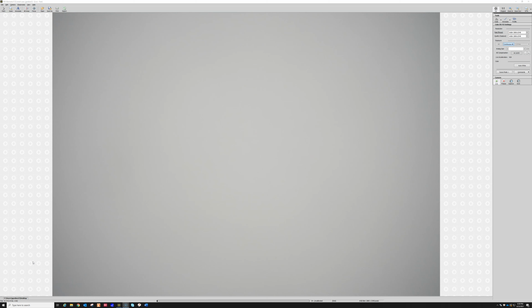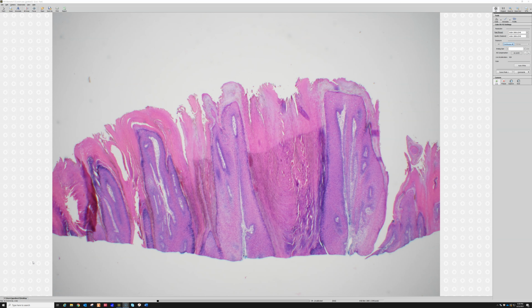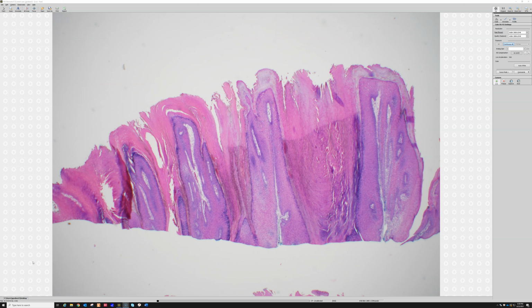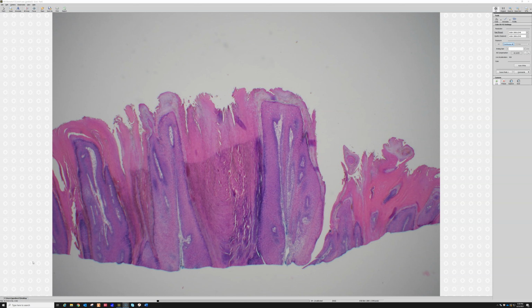All right, a few more to go, and then we'll be done. If you're still with me, you are a trooper, and you're going to be the master of all verruca from this day forth. Now, here's an example of one of those transected ones.